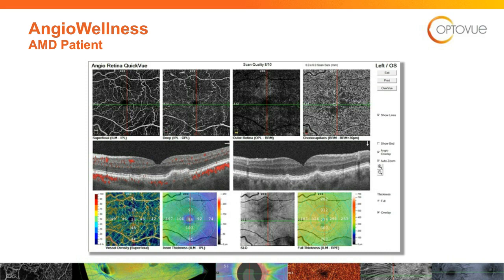Question rolled in: can signs of Alzheimer's be seen with an OCTA? The quick answer is yes. Duke recently put out an article that in dementia and Alzheimer's patients there is a correlation, but in talking to all the colleagues out there, more work needs to be done.